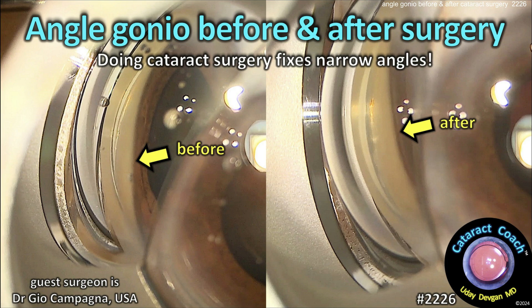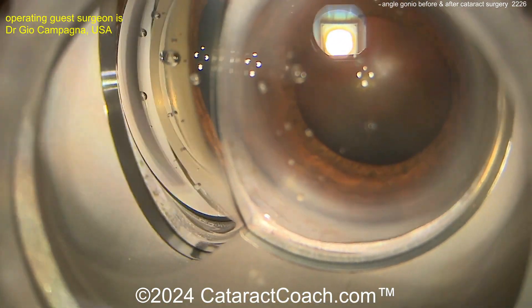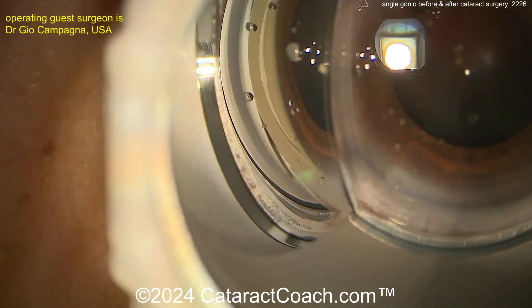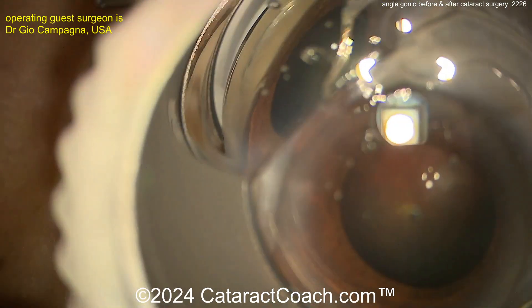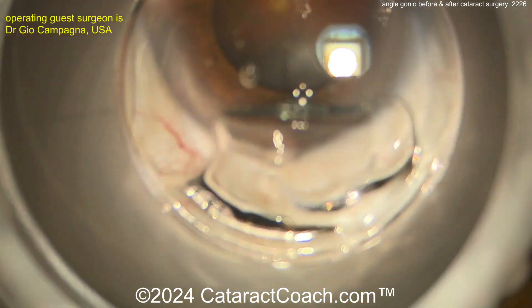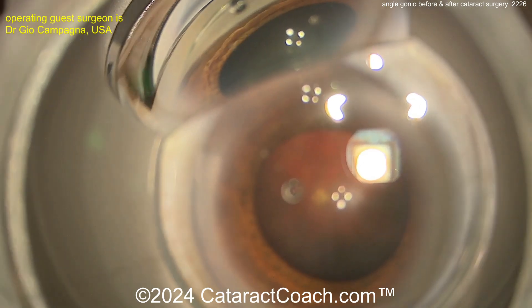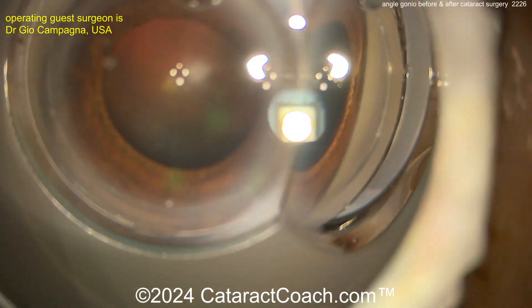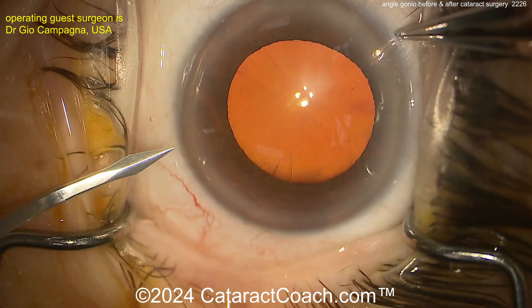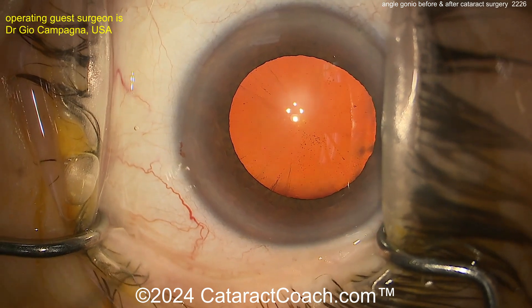So now we know, doing cataract surgery really does fix narrow angles. Here's a patient — you put the gonio mirror on top of the eye at the beginning of the case and take a look at the angle. The patient has very narrow angles. You put that mirror on, rotate it, and you get a 360-degree view of the angle. Looking at the other side as well — maybe even some angle closure, history of angle closure — but very narrow angles.